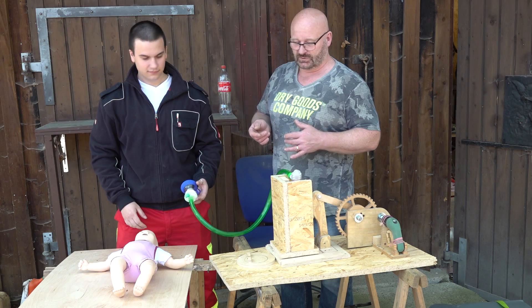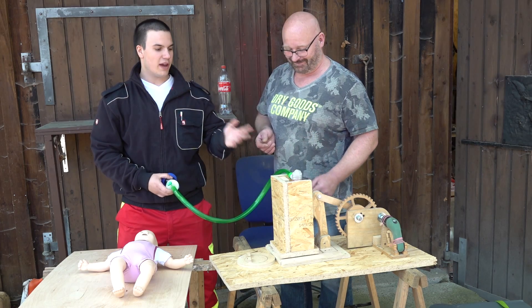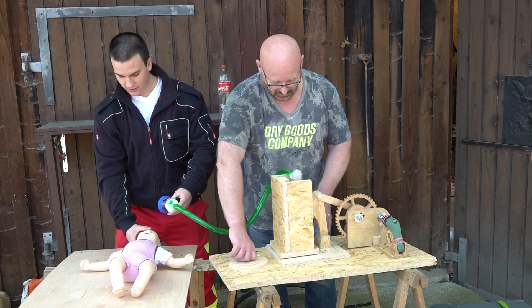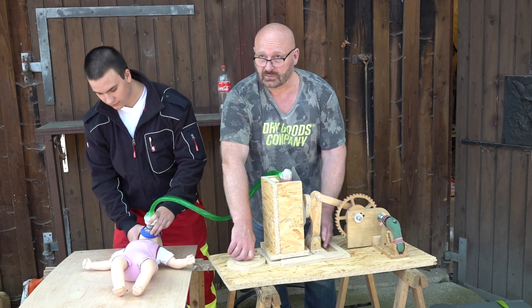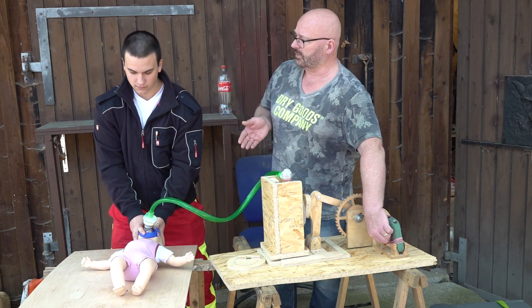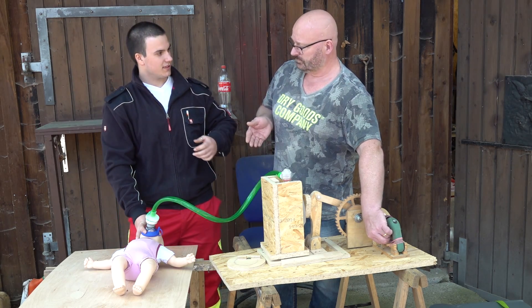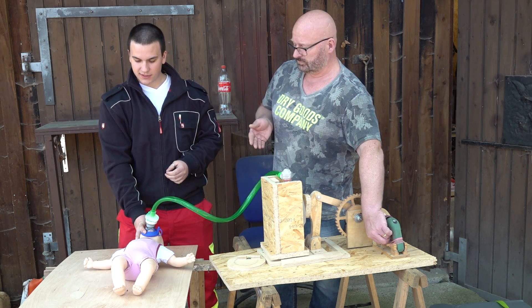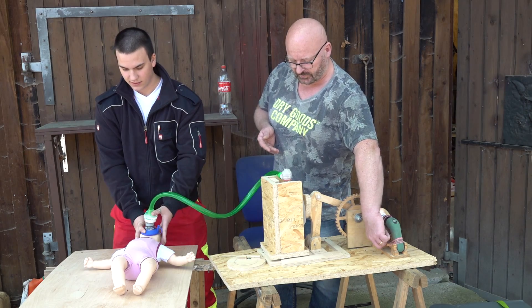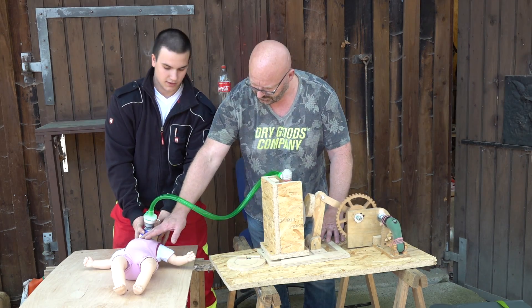Now we have a new challenge: using this for ventilation of a baby. We have to barely touch the respiration bag, so first we go down in volume very much so we can adjust it. The frequency in CPR is exactly the same — 30 chest compressions and two ventilations. Let's give it a go. Is this already too much? I can see it here.